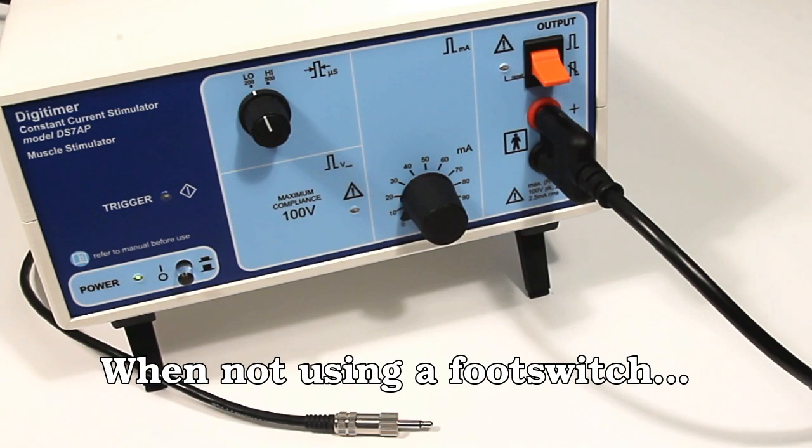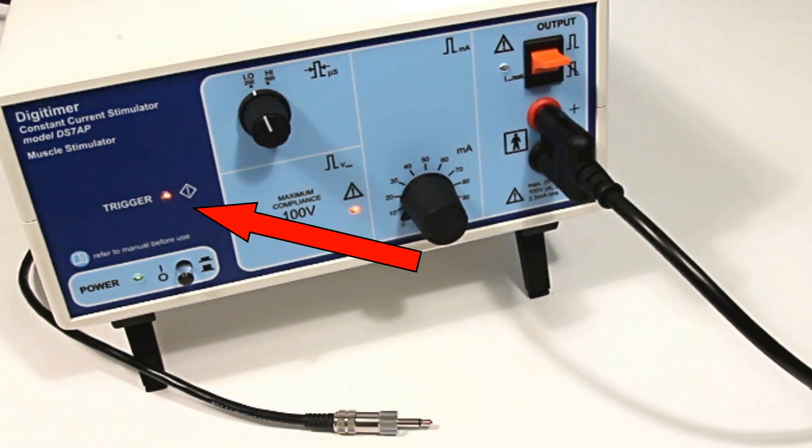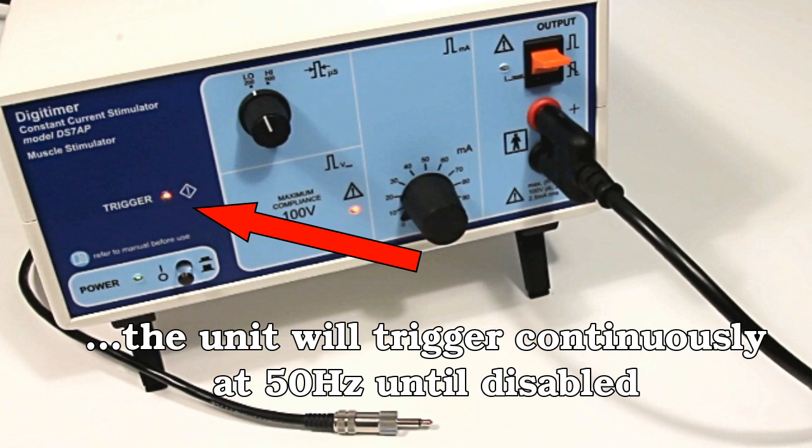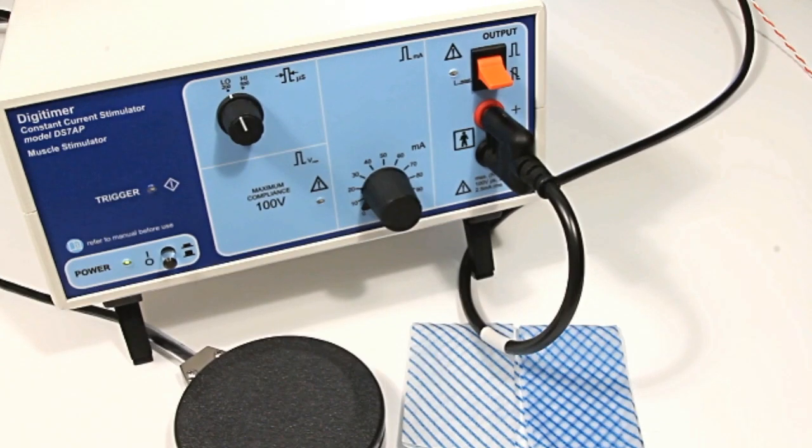If a footswitch is not connected to the stimulator, stimulation will start as soon as the output enable toggle switch is pushed up and will cease when it is pushed down. Stimulus delivery can be verified by observing the status of the trigger LED.